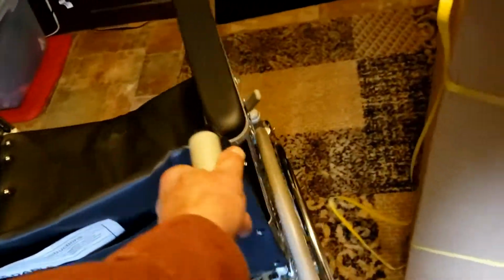Okay, it just pulls apart. You level across. Wheel locks, both sides. I don't know how much one of these actually costs medical wise, but I'm sure they're not $100.